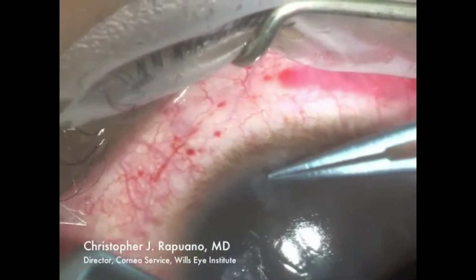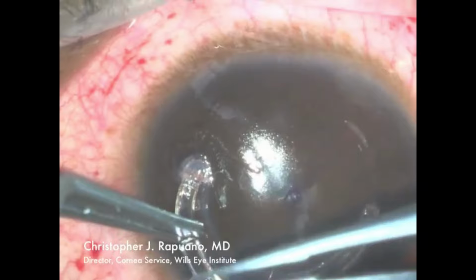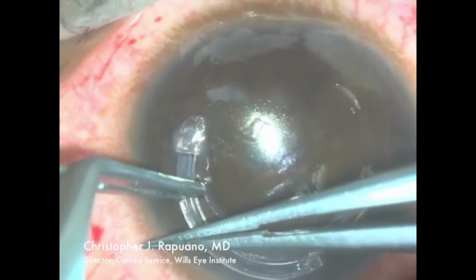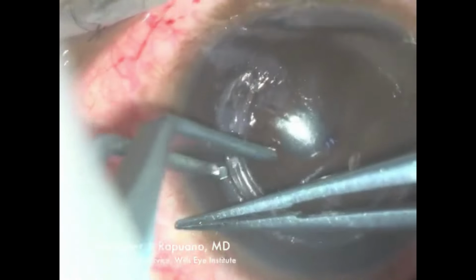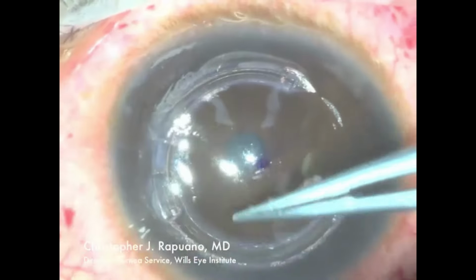Now the superior Intacs segment is being placed. Again, it's a little trickier to get the second one in compared to the first one because there's already space being taken up by the first Intacs segment. Here it's being pushed deep into the wound, and then once the channel is found, it can be, ideally gently, but sometimes somewhat forcefully, rotated into its channel.